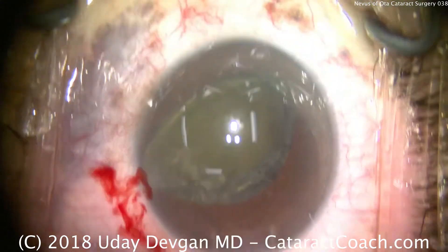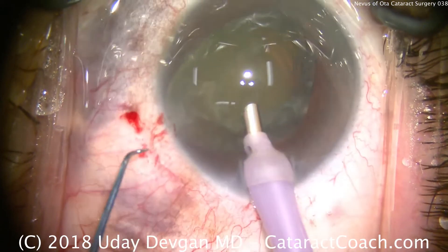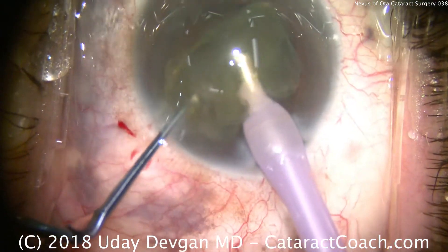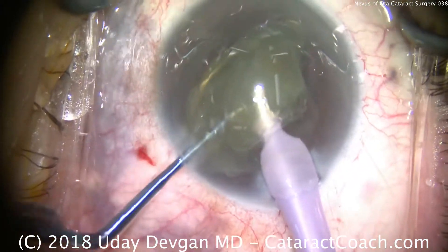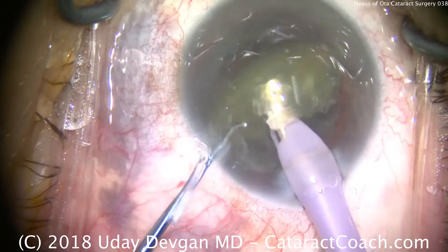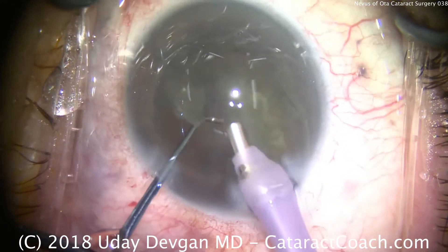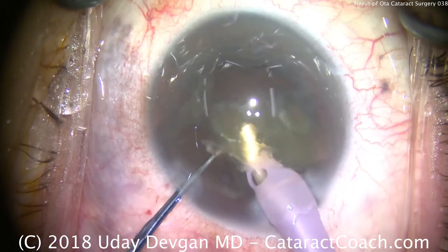More dispersive viscoelastic to protect the cornea. Now we'll take our phaco probe — we're going to use a high vacuum, high flow setting. Hold the nucleus with the phaco chopper and then the probe, and we split it into pieces. This patient is lucky she doesn't have a very dense cataract, so this one will be quite easily removed. We adjusted the microscope lights for increased brightness, keeping the nucleus in the center at the pupil margin — the iris plane. We can phaco-aspirate the entire nucleus, with the chopper held in a safe position to protect the capsular bag.